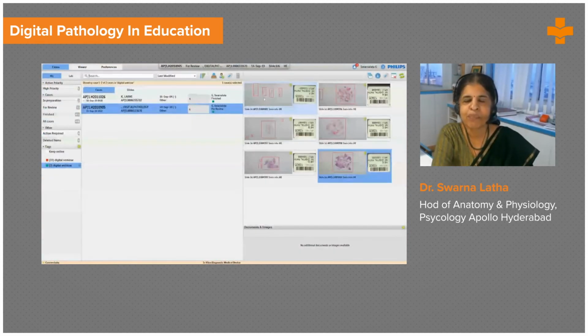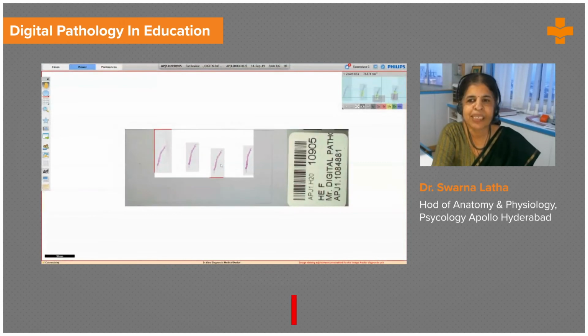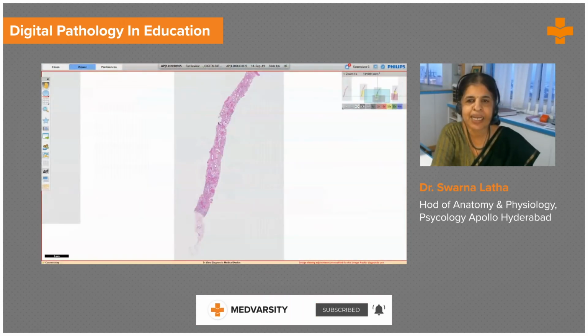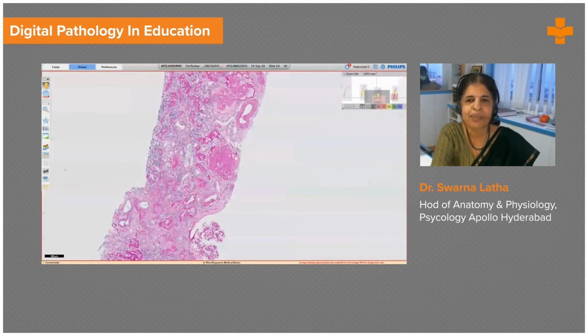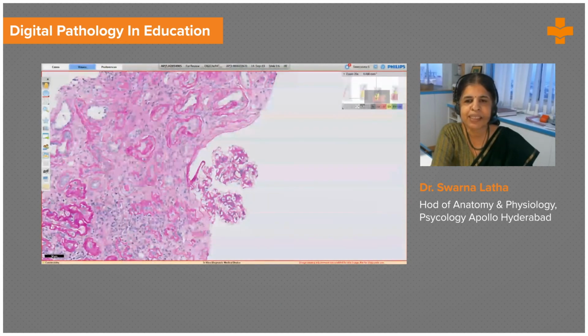I wouldn't want to complete this without showing you one of my favorites, which is the renal biopsy, because not many people get interested unless they actually see these beautiful images of cores. And even for the lay people in this audience, you can see that these are glomeruli, these are completely sclerosed. This is one where the matrix, that's this positive magenta material, is so much more.